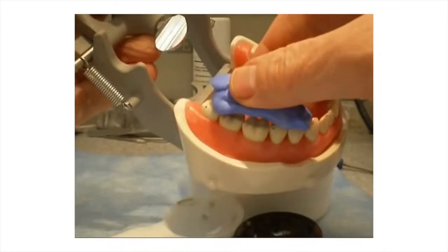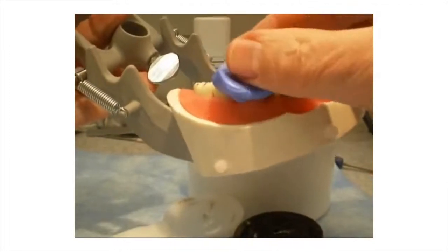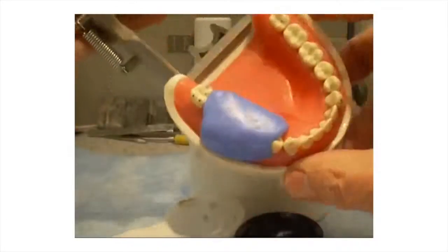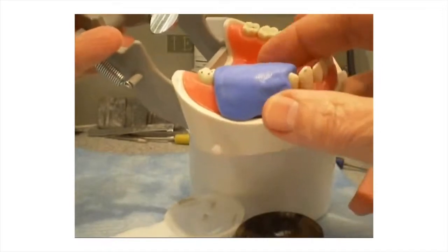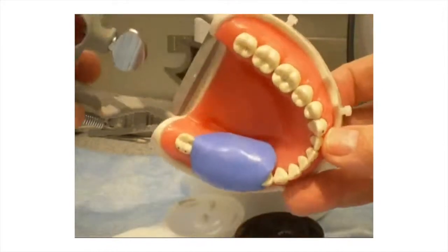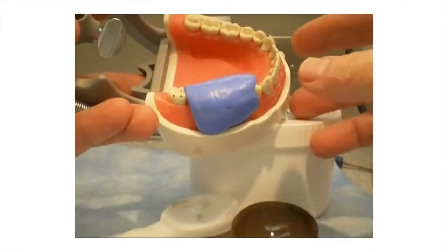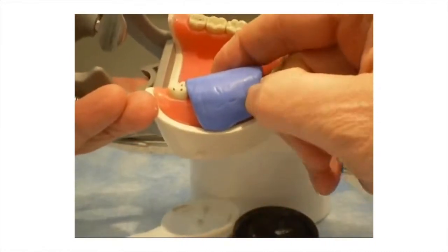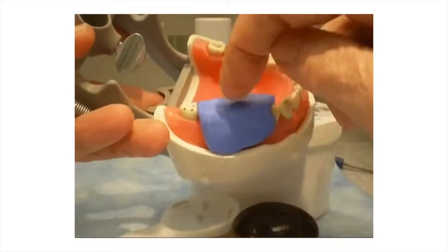The putty is placed over the desired preparation area. Place the material and allow to set. When the material can no longer be indented, remove it from the model.